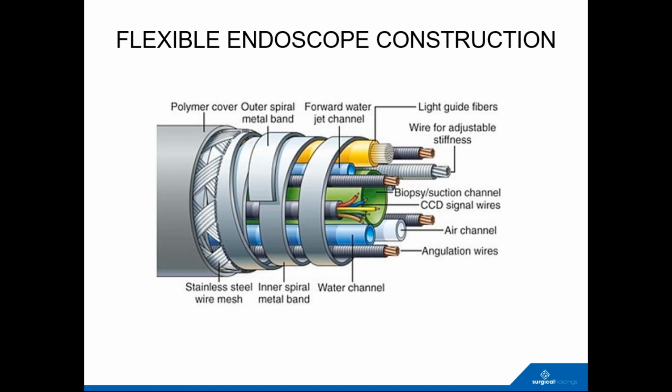And that was something which I actually got involved with many years ago. To give you an example of the complexity of the insertion tube characteristics, from first concept of getting variable stiffness in a colonoscope to pre-production was around 10 years. So these things are really quite complicated. Then also you have a suction channel, air and water, and CCD wires in the case of a video scope, and a coherent fiber bundle taking the image in terms of a fiber optic scope.